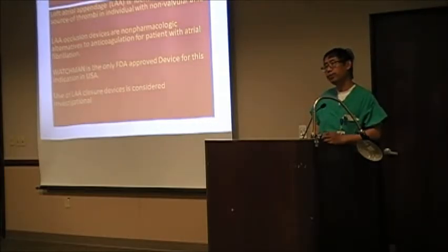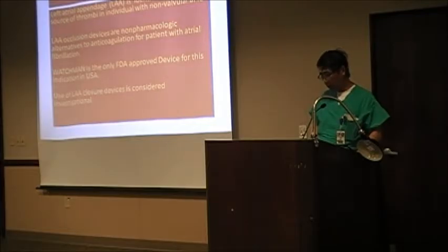Any other questions? Don't you have, what about that slideshow? Yeah, I want to see whether I can give you guys a movie about the closure device, what they do.